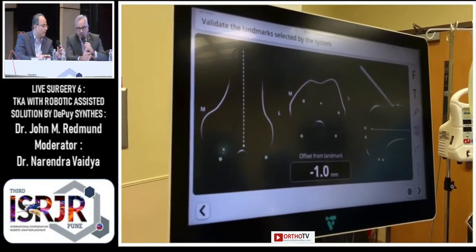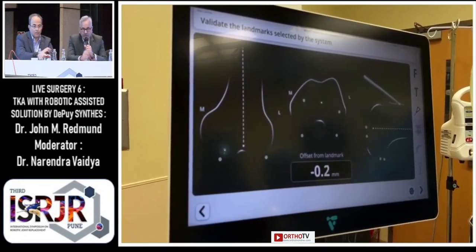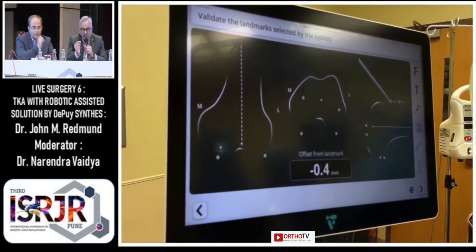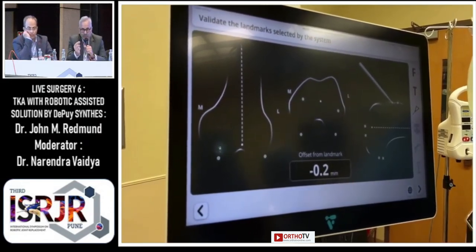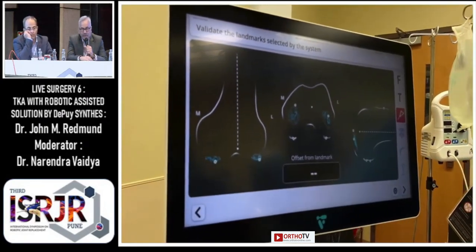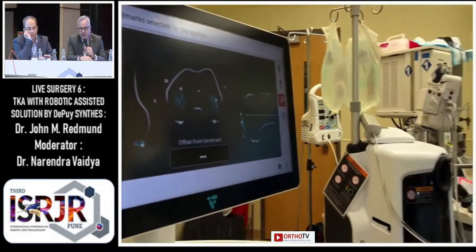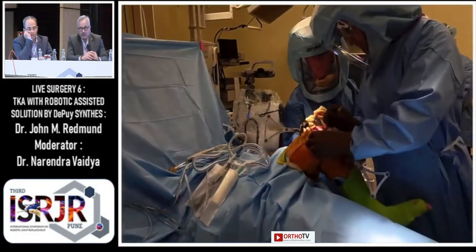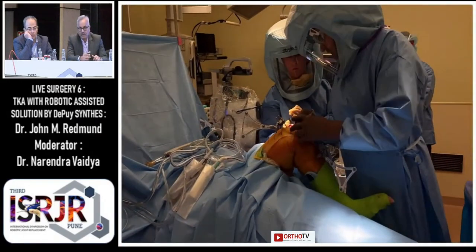Regarding how much distance is accepted: there are a couple of things I'm checking. One is that I didn't step on the pedal while the probe was off the bone, so I didn't collect any error — an air ball or a point that's not actually there. I'll accept anything within about 0.2 to 0.4 millimeters.